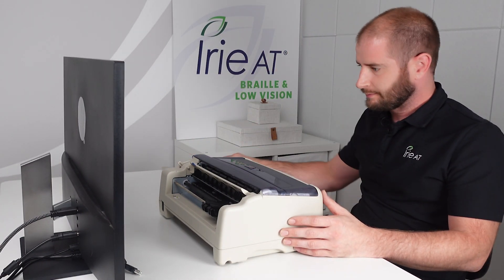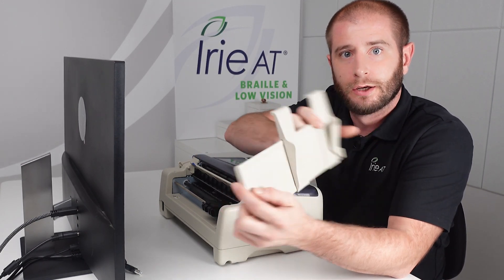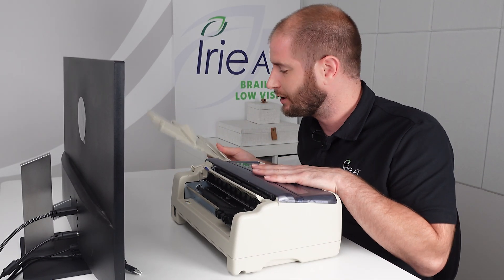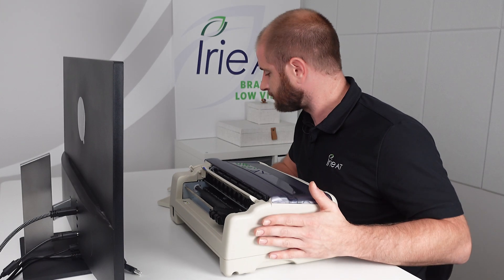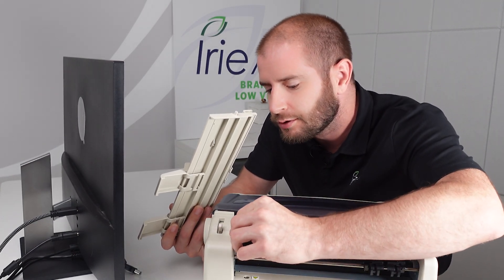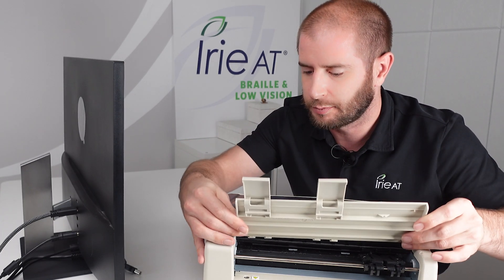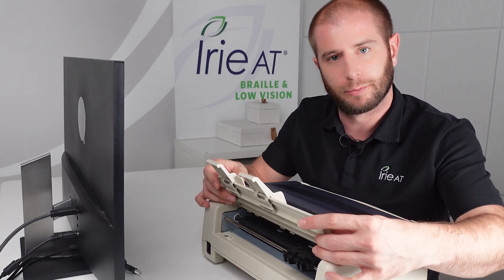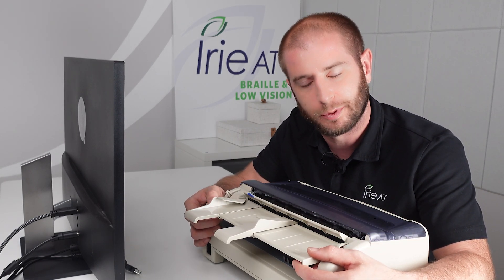The last thing that came included, that's loose, is the paper tray. This serves two purposes for the BrailleBuddy — it's for both tractor fed and cut sheet paper, which is one of the neat things about the BrailleBuddy. We're going to install this tray now. You'll notice there are a couple of grooves and knobs on the back of it and it will slide into place and lock in. The upright position is for cut sheet paper; the downward position is for tractor fed paper.